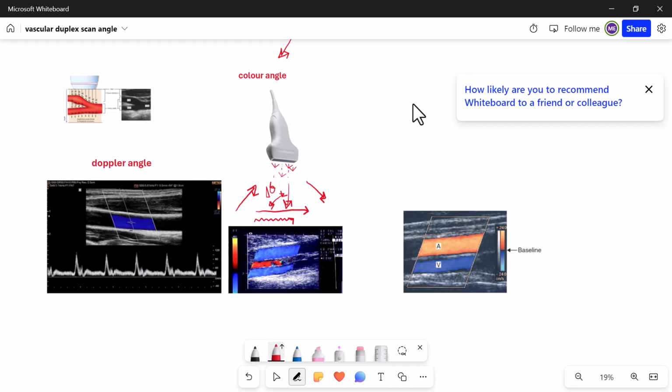So if you want to have color saturation of your blood vessels, like this image, for example, you need to make the color window, instead of being perpendicular, to be in this scenario, either right or left, whatever you choose. So by having this kind of deviation, you either go oblique from that side or you are oblique from that side, like this one here.